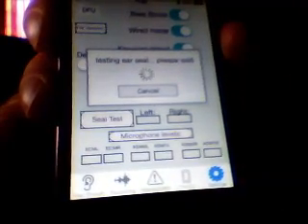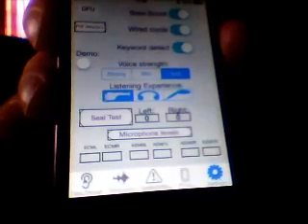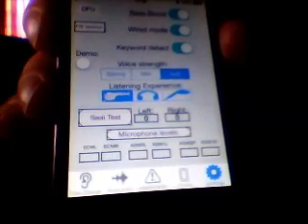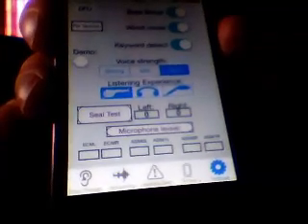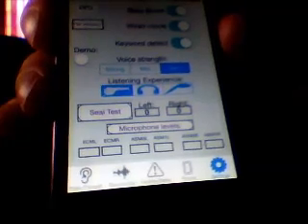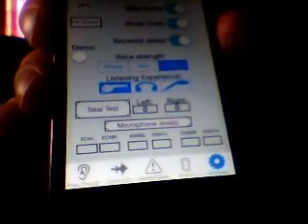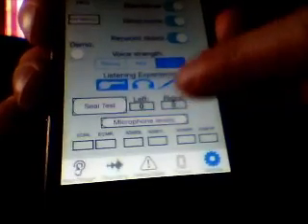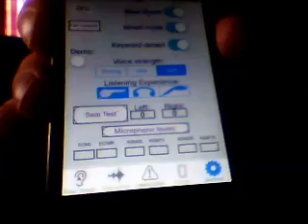Now this seal test button here, when I press this, it sends a BTLE command to the earphone hardware to start a seal test in the earphone, and this returns a goodness of fit value for the left and right earphones, which is displayed in the box. You can see it's displayed 2 zeros here, which is a poor seal.